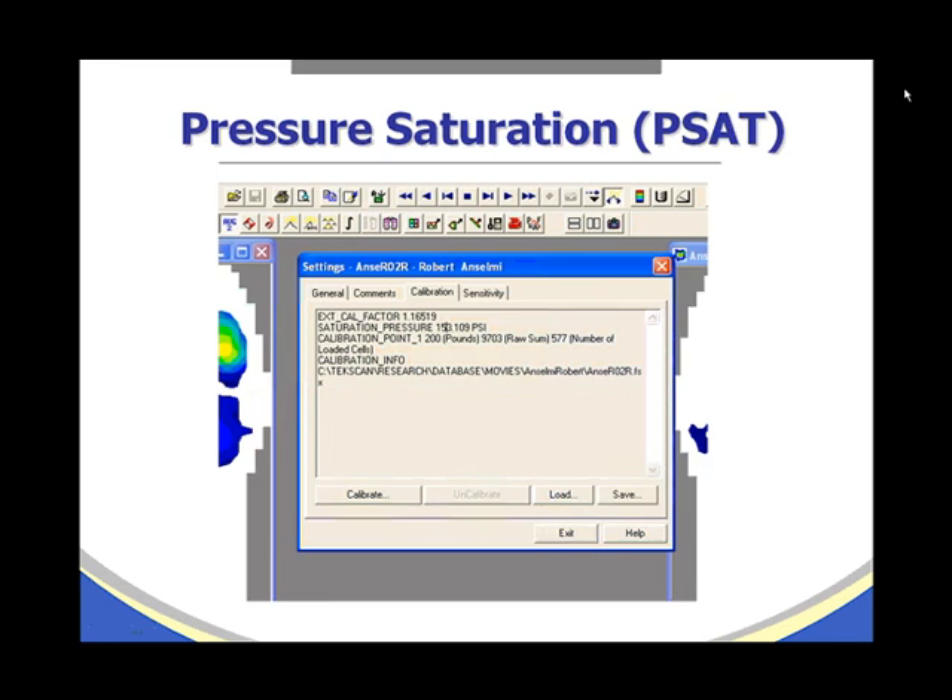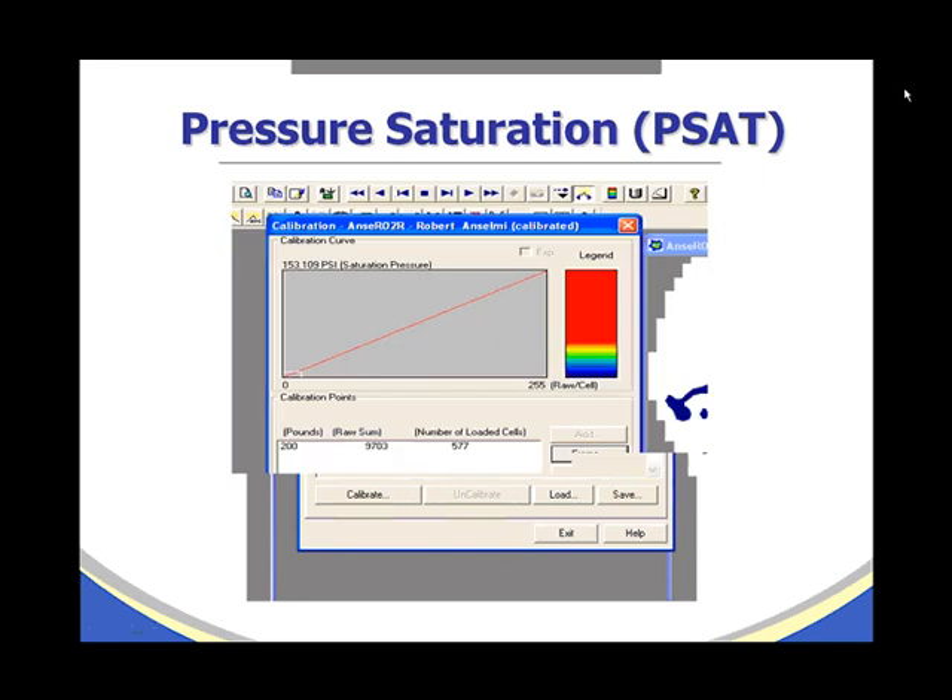Pressure saturation, or PSAT: after calibration is performed, the sensor software computes a pressure saturation value. In this example, the saturation pressure is 153.109 PSI, meaning the sensor can read pressures up to 153 PSI. If a higher pressure is applied, it will under-report, as it cannot read above that value. We would like to see a saturation number under 250 PSI; once exceeded, it is a good idea to discard the sensor and use a new one.